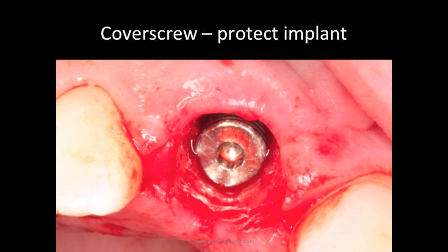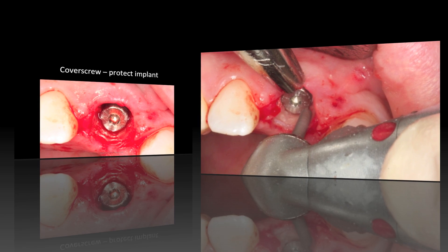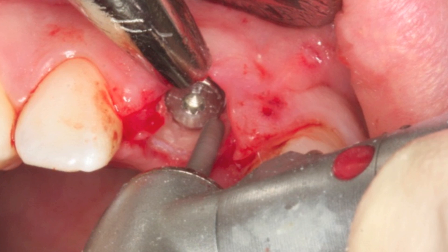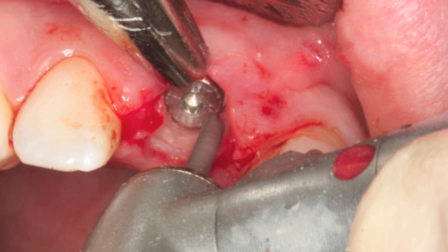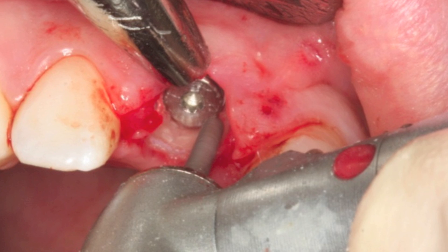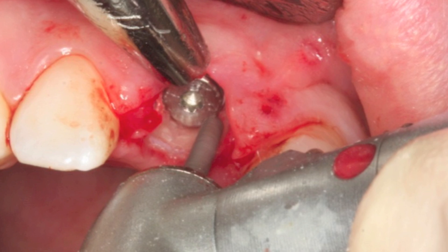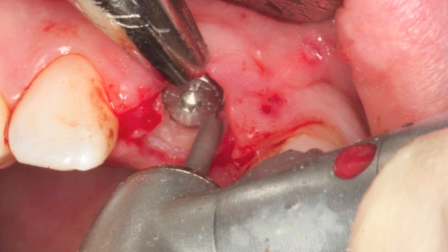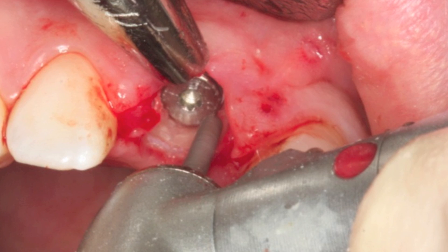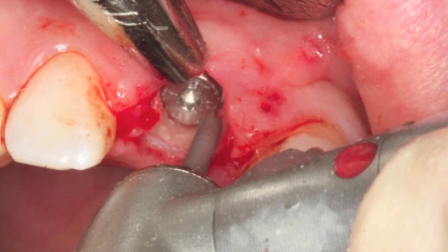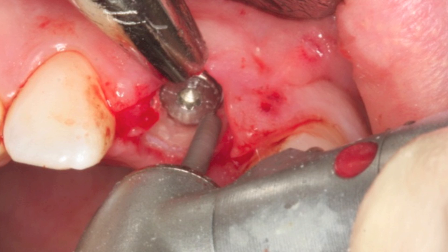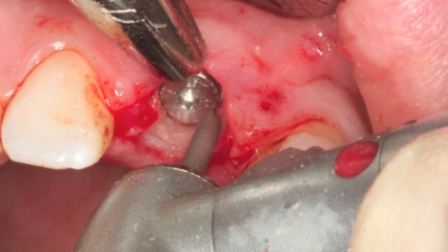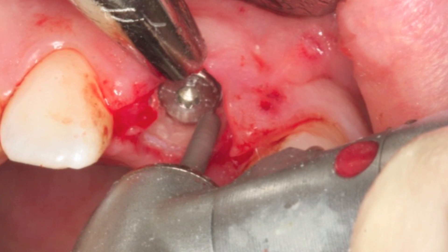Once the cover screw is on, you can take a diamond and start to cut the lingual bone back. You need to think about what the shape of that red ring is. We get that cleared out of the way, and this is going to enable the new crown to seat three months from now. The buccal is going to have a jump gap, and the distal and mesial are going to be kind of cleared out anyway, so we generally have to just remove in the lingual area.